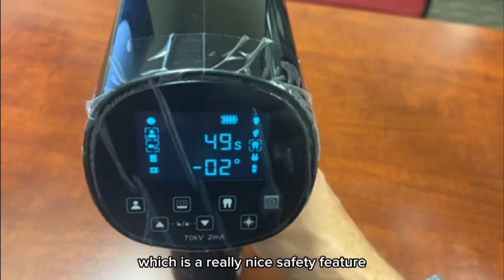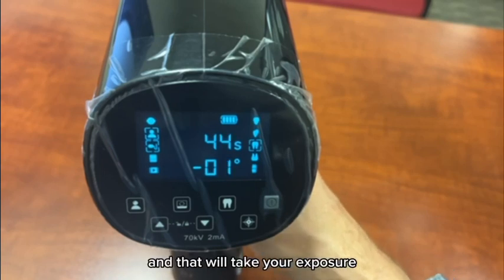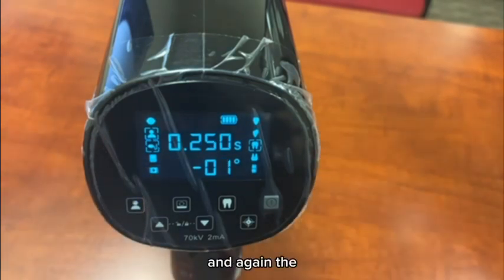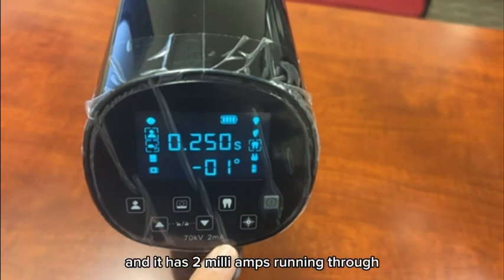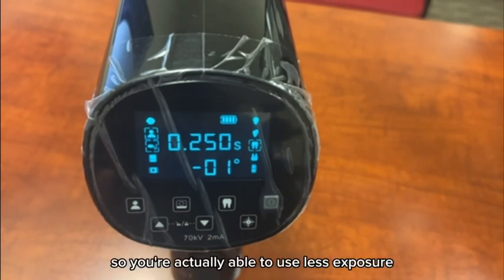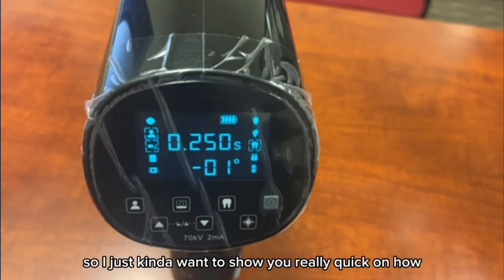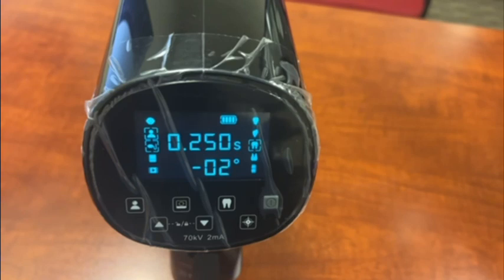It does have a safety feature — you press the exposure button one time and then you have a countdown from 60 seconds, so you don't accidentally press the trigger and shoot an exposure, which is a really nice safety feature. Once you're ready, go ahead and press and hold the button and that will take your exposure. If you want to exit that, just press any button and it'll exit right out. And again, this unit has 70 kVs and 2 milliamps running through it, so it is a very powerful portable x-ray — you're actually able to use less exposure than some of the other handheld units to get that same shot.